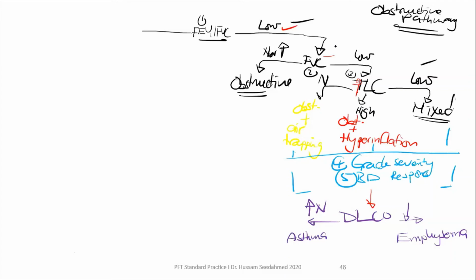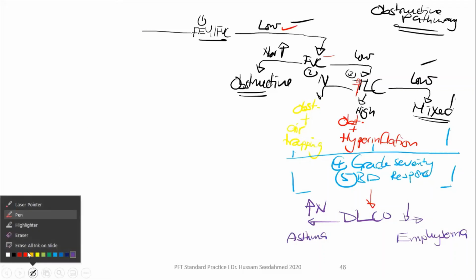Excellent. So now بنفس الطريقة we will move to the restrictive pathway اللي هي حنتجه الآن إلى اليسار. Now we move to the restrictive pathway.